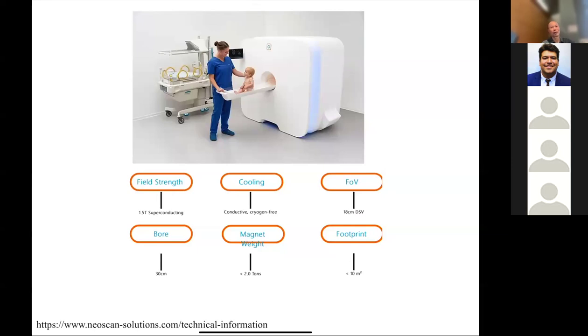All right. So people unfortunately have died because of that, especially people installing MRI systems who just weren't aware there was a helium leak, and all of a sudden they suffocate and fall off a ladder or something like that, and they die. Okay. So I'm just giving you all the dangerous parts today, so you have respect for the system. All right. Luckily, this system here would be fine because there's no helium, right? So you just have to worry about things flying into the magnet.